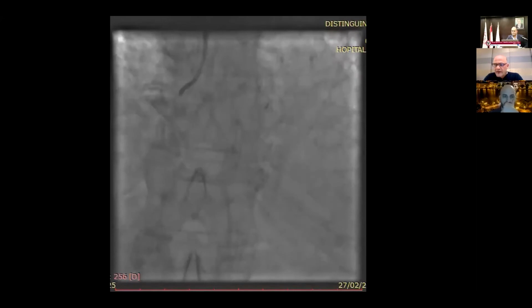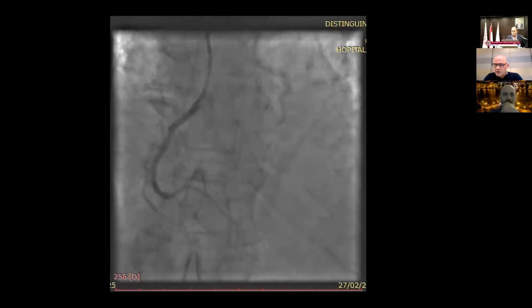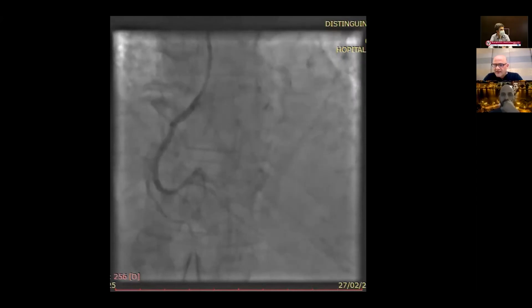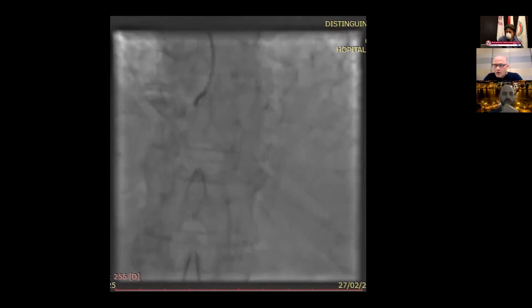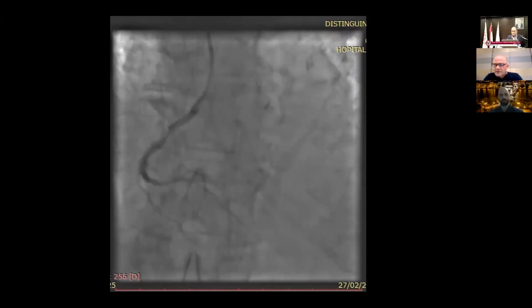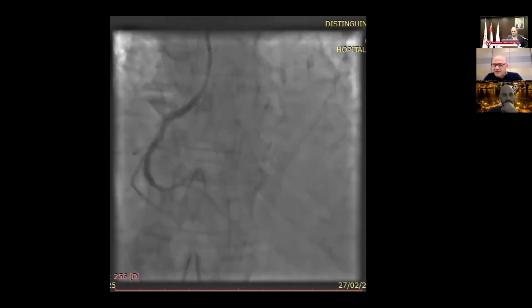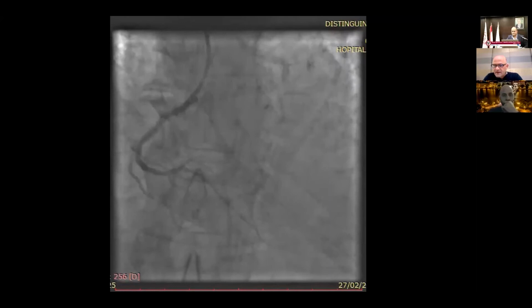Would you recommend, in retrospect, if we opened the culprit lesion, which is the circ, in a shocky state, to attempt opening this artery in a center with no rotablator? Because I think what has been done for this vessel, attempting to open it by multiple ballooning and wiring, is that we lost TIMI 3 into TIMI 0, and the patient was in shock.